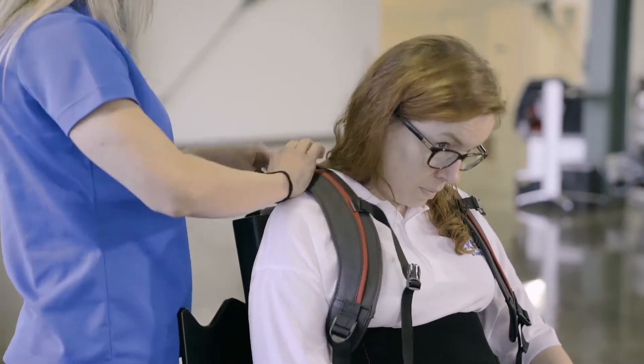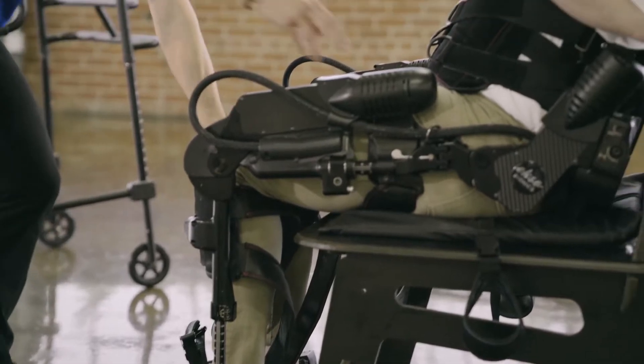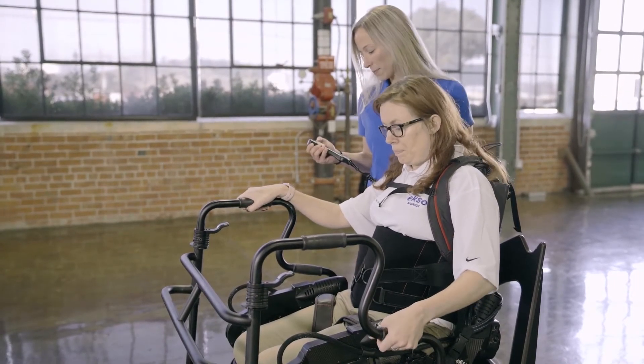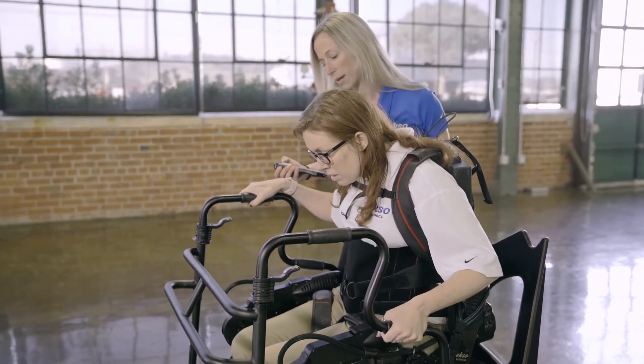Doffing XO happens more quickly and can be done in one or two minutes. The sit-to-stand is fully powered by XO but requires patient interaction to be ideal. XO has two options for the sit-to-stand based on comfort for the patient.